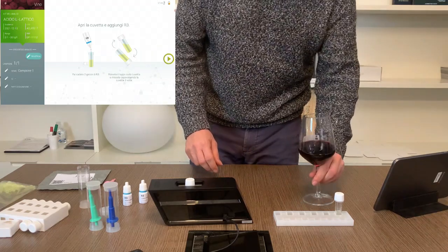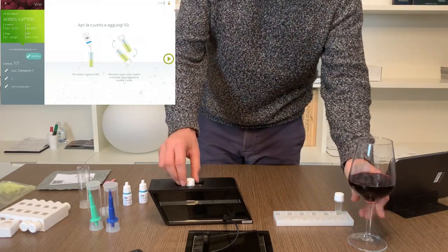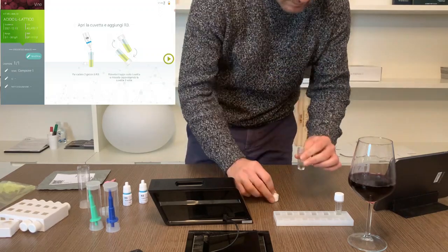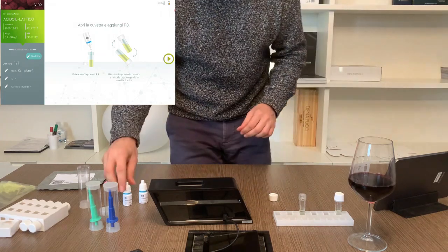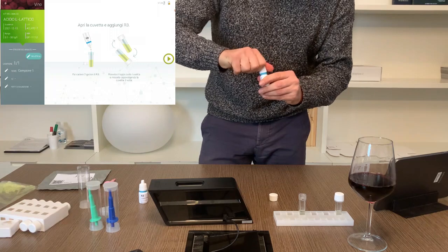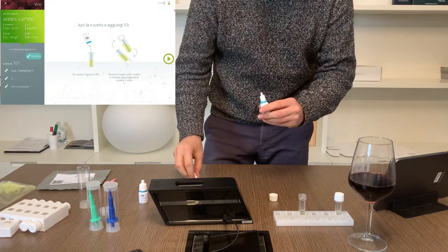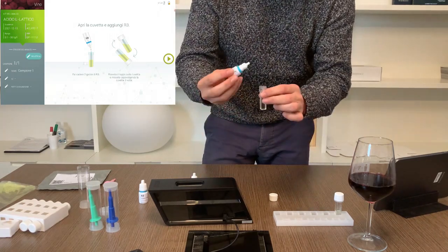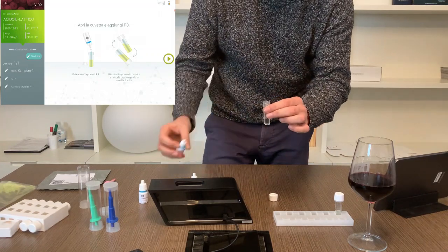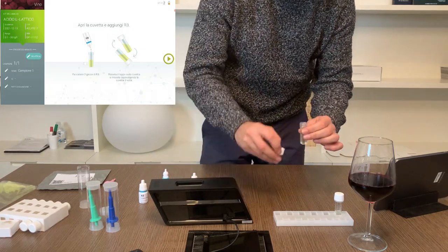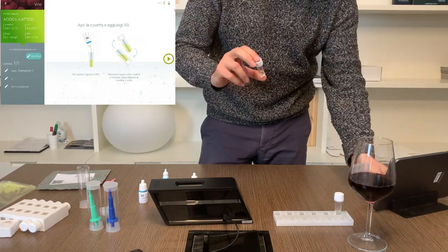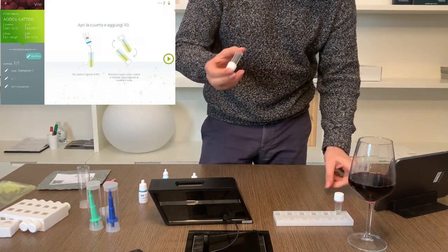At this point the last step of the analysis requires you to add the R3 reagent with the dropper, so proceed exactly as you did with the R2 reagent previously. Turn the dropper upright, press down lightly and drain. Always invert to mix the reagents you have added and place back into the instrument with the smooth side towards the logo.